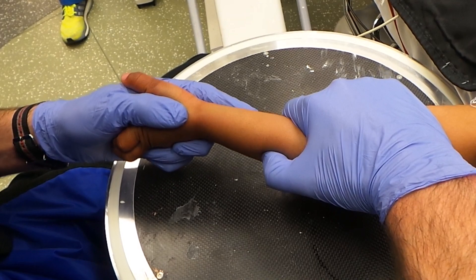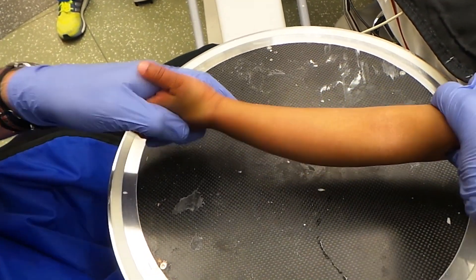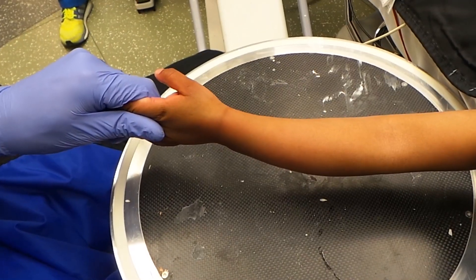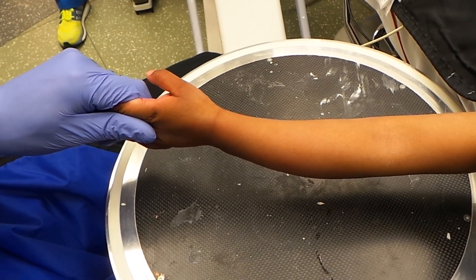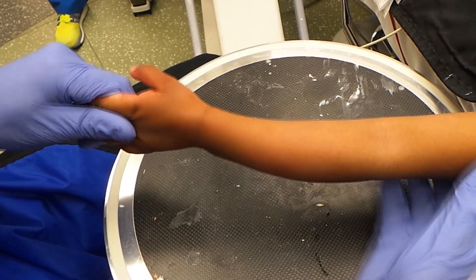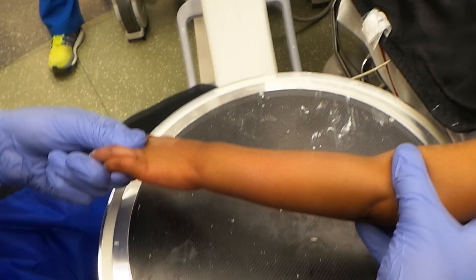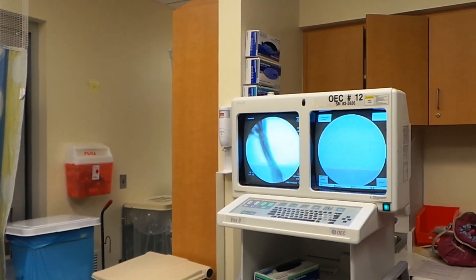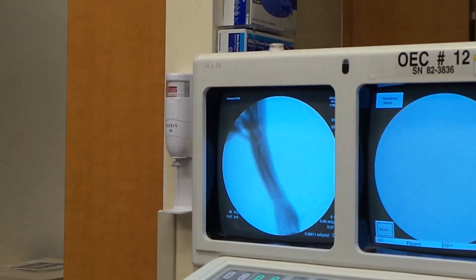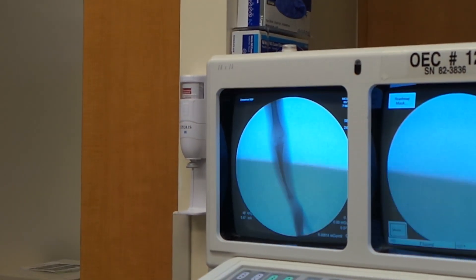So what exactly are you doing? You're putting pressure right over the injury, and then distally you're pushing backwards, right? Right. Thumb right on the injury side, just to give something to lever against. So we've got excellent alignment on the radiograph now. That's a fairly simple reduction.